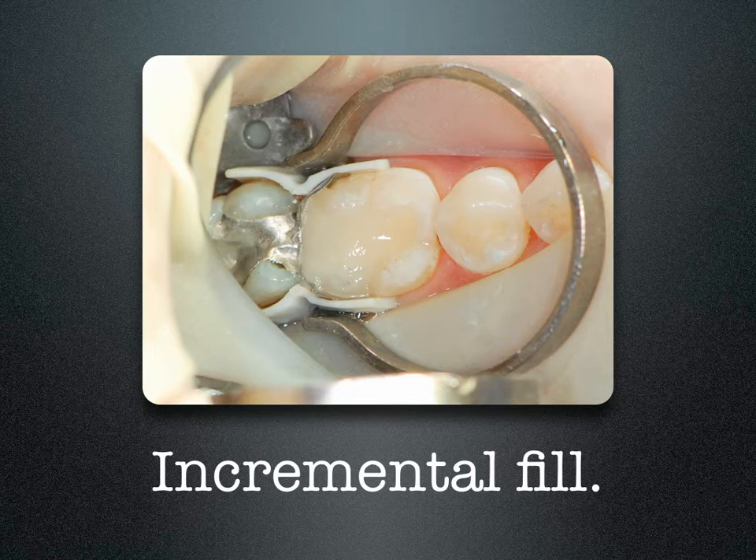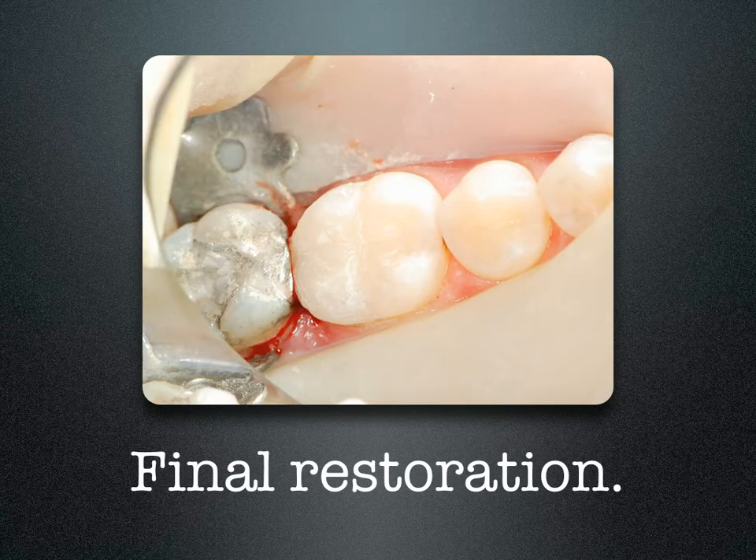You can fill this tooth incrementally with any posterior composite, trim it back, and that's the final restoration. As you can see, it has a very broad contact and proper embrasure form.